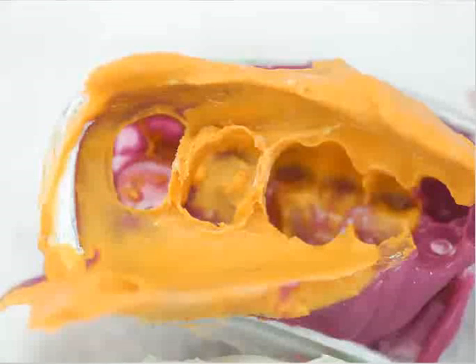Because there are problems that we run into from having to deal with improper techniques or improper impressions that create issues. A study a few years ago in the JPD cited that over 50% of the impressions that were submitted to the lab had visible defects in the marginal areas that were potentially disastrous, and that can lead to all sorts of issues.